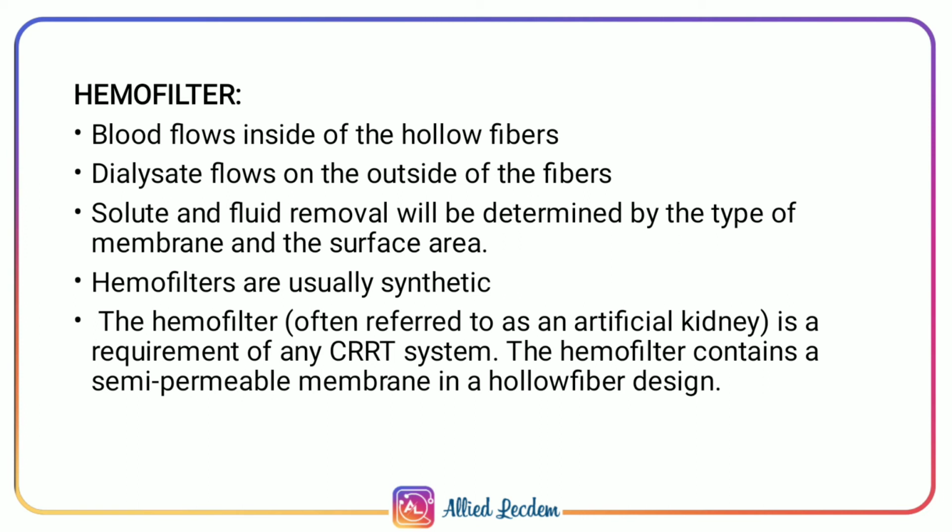Hemofilter. Blood flows inside of the hollow fiber. Dialysate flows on the outside of the fiber. Solute and fluid removal will be determined by the type of membrane and surface area. Hemofilters are usually synthetic. The hemofilter is a requirement of any CRRT system. It is referred to as the artificial kidney.